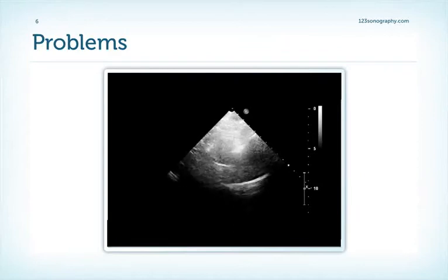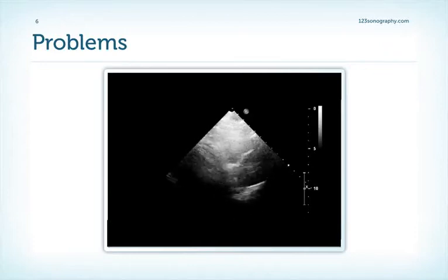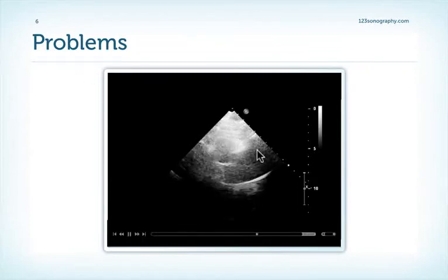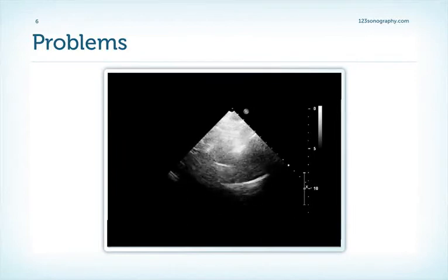Now, the patient I investigated had a known dissection in the abdominal aorta, so I was kind of convinced that dissection was also present in the ascending aorta, which is an indication for operation, and that's where I actually sent him. Well, fortunately, we also performed a TEE study and there was no dissection. And we also performed CT and there was also no dissection. What we saw was an artifact. As a matter of fact, an artifact which is not so infrequent. This is a reverberation of the aortic wall, a form of artifact that I will be discussing in this chapter.